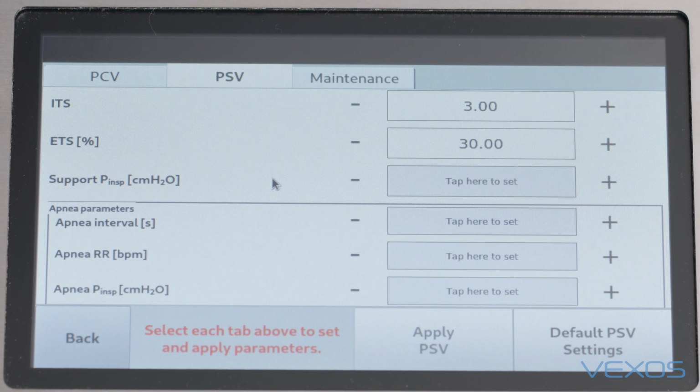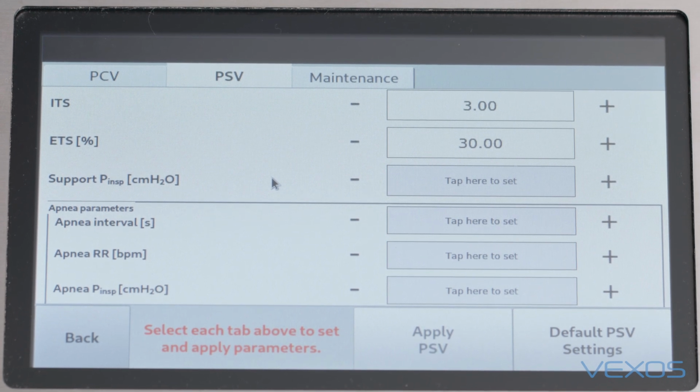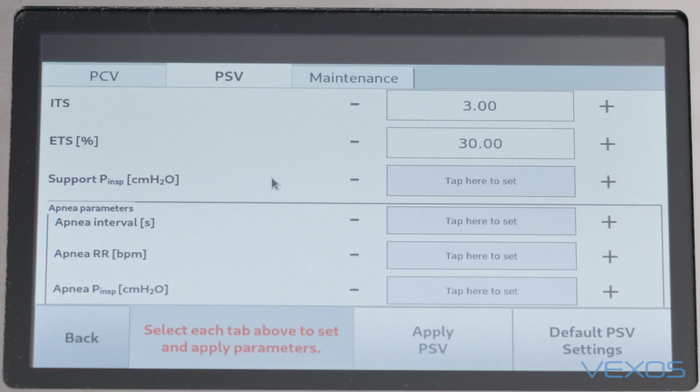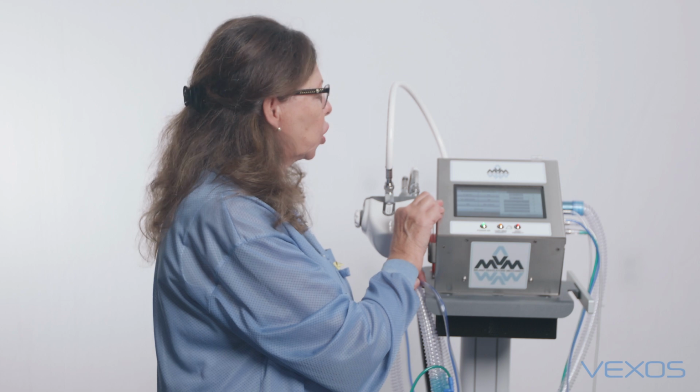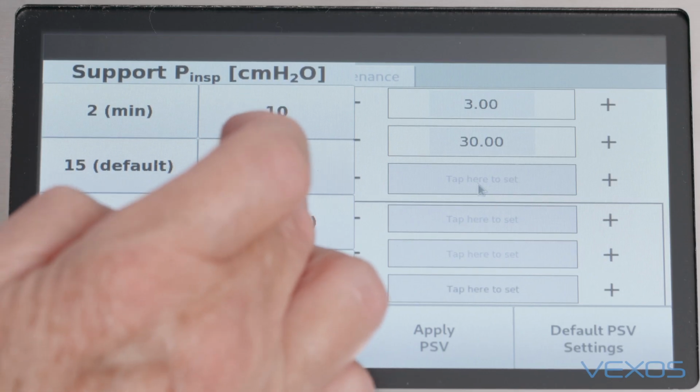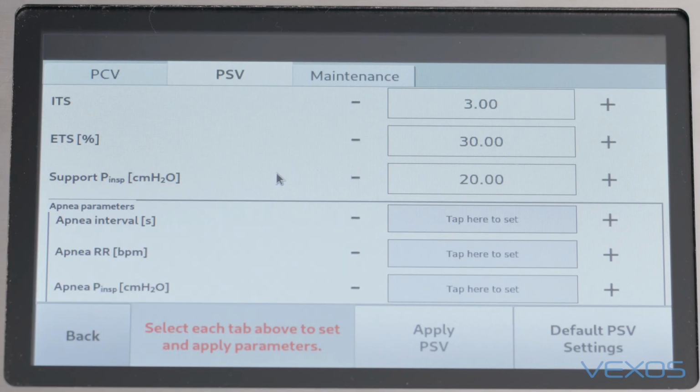The third parameter or setting to set in pressure support ventilation is the pressure. It is called support P-insp, the pressure for pressure support. Again, tapping here provides me with that selection. I'm going to press the default, and those three are done.